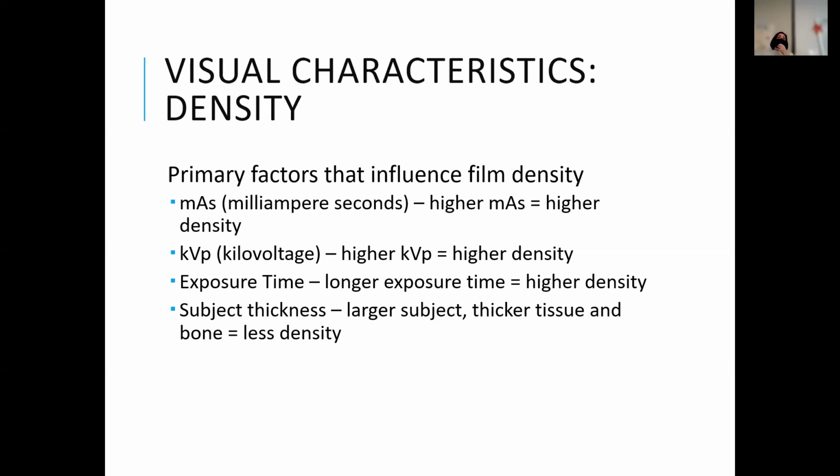If you were to try it with Dexter just for fun, it's not going to be a super drastic difference like night and day, but it can be, depending on who you have in your chair. Let's say you put Dexter there and take an anterior PA and set it on a molar. You're just going to see that it's darker. Then set it back to anterior and compare, so you can visually see that effect, because that may help solidify it.